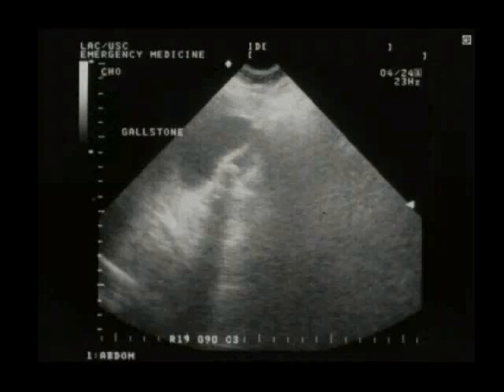Here's a case that was seen at USC, and one of the residents marked this down on the image and submitted it into our logbook. And he has correctly identified the gallbladder, but then he annotated this by saying it's a gallstone. And he was looking at this hyperechoic area and this shadow. Does this fit the criteria that we just went over? Remember, the first thing is this stone has to lie in the gallbladder.